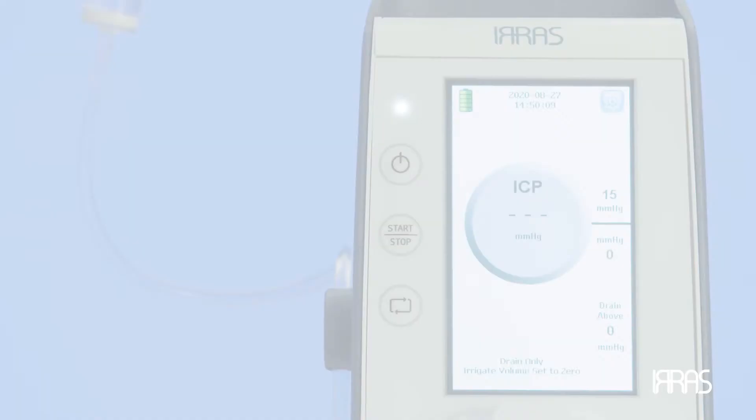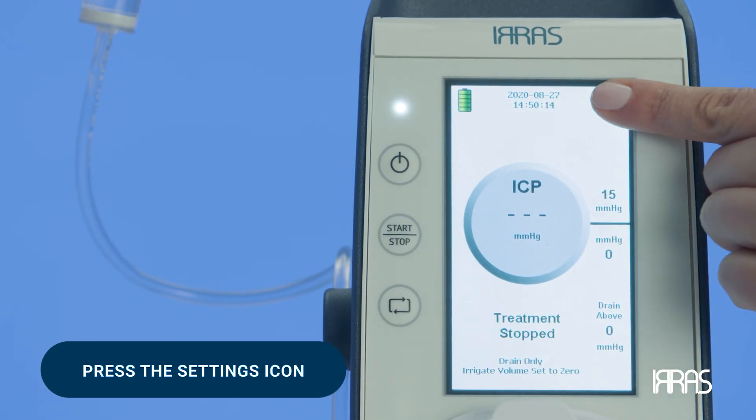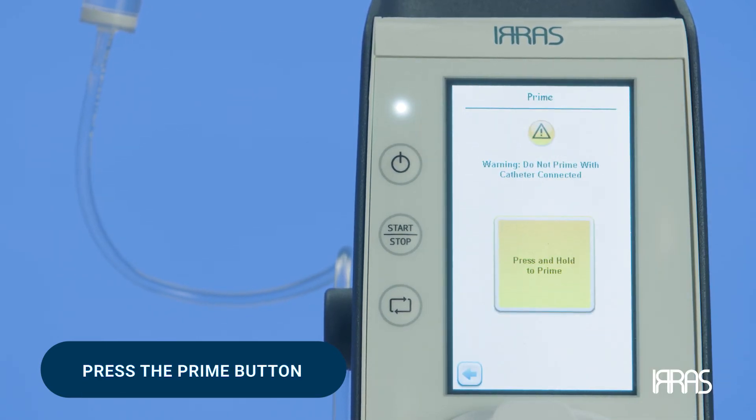Priming. Now it is time to prime the system. To do this, first press the Settings icon. Once you are in the Settings field, press the Prime button. To prime the system, press and hold down the Prime button.